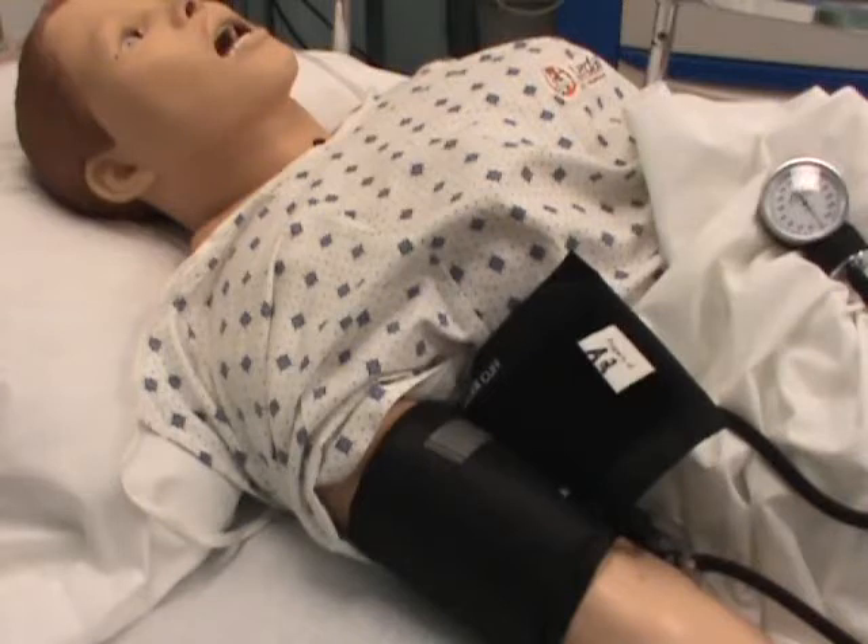Remember, we have to calibrate the blood pressure cuff first as shown in previous videos, and we can only use the blood pressure cuff that comes with the mannequin from the manufacturer.